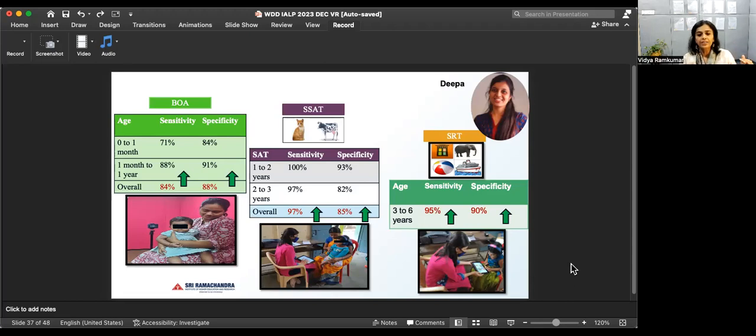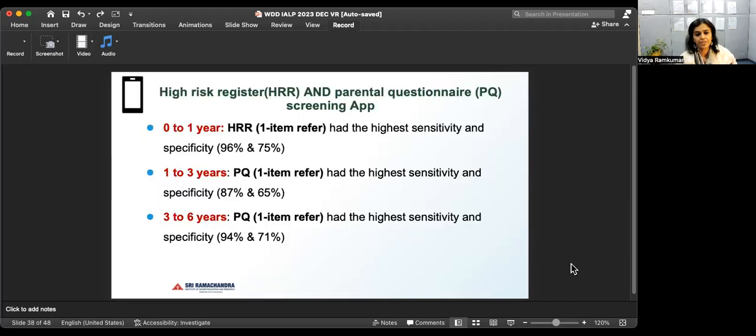and right now we're targeting this as a 40%, which is 60 decibels of hearing loss. That's the screening level, but we've put in R&D to lower this level. We've taken the slightly higher level because that's the level that's considered as disabling hearing loss for social welfare schemes within the government here currently.